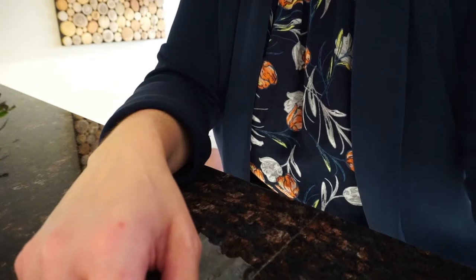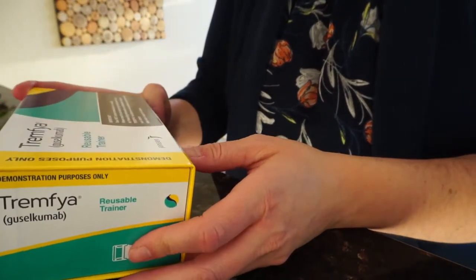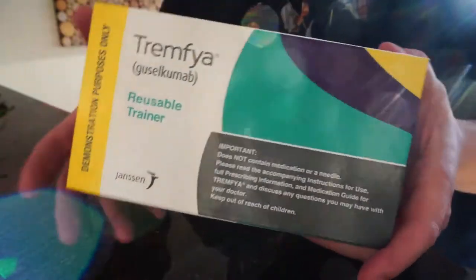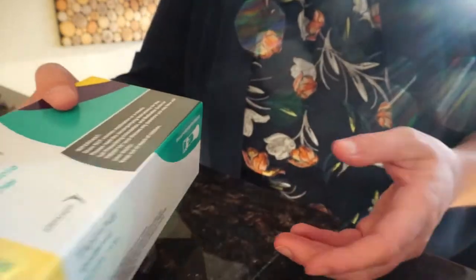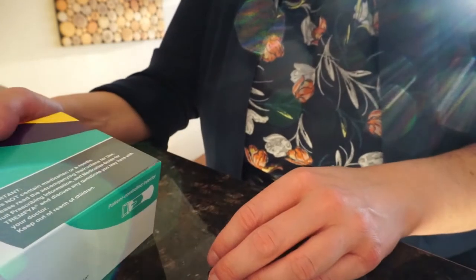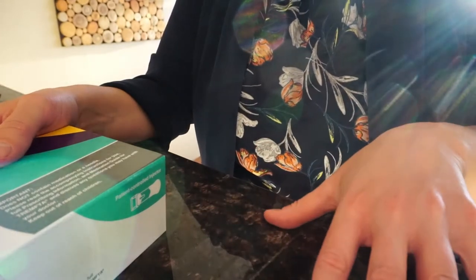We're going to start with the demonstration of how to self-inject Tremfya. First things first: you're going to receive this box or multiple boxes of Tremfya. It's very important to put this in the fridge as soon as you receive it. When you're ready to inject, take your box out of the fridge and let it get to room temperature — that'll take about 30 minutes to one hour.